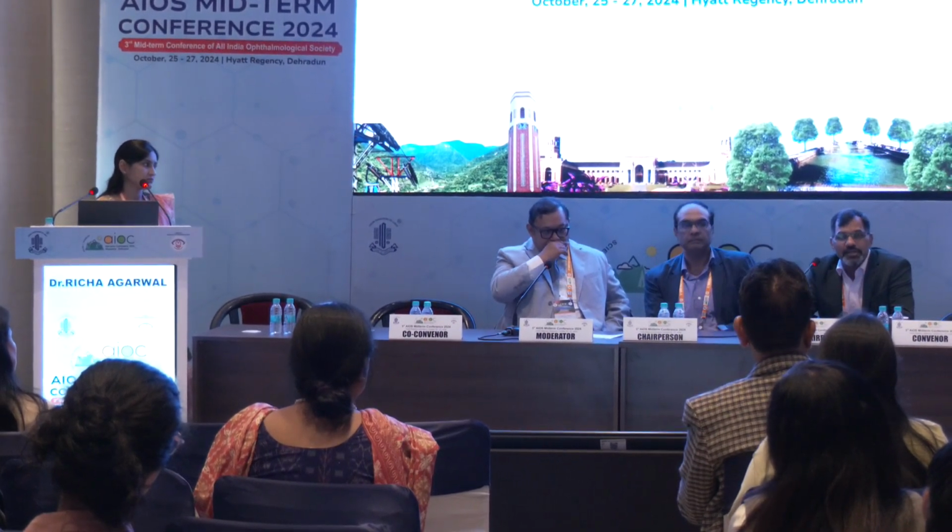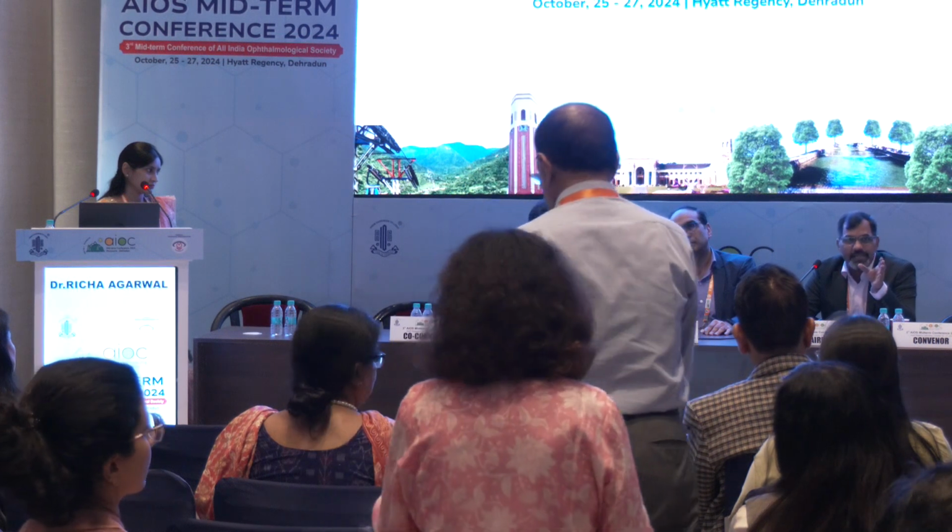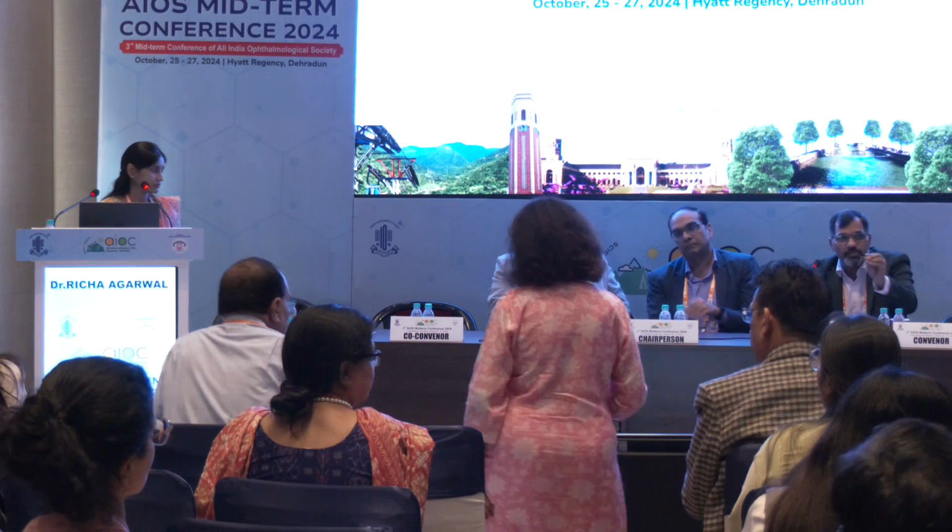On the ESCRS website, you can put in the data and 4 or 5 formulas there will give you what the IOL power will be, so then you can compare it. Barrett Universal 2 is the best. But still, if you want to go further, in an extreme eye you can go to that ESCRS website. Multiple formulas are there, put in the data, and they will give you, according to EVO, Barrett, all these formulas, what the IOL power should be.